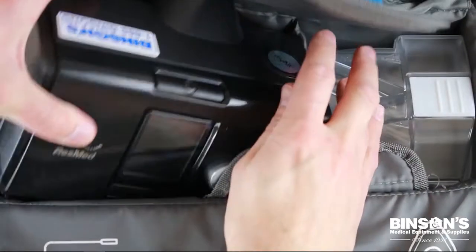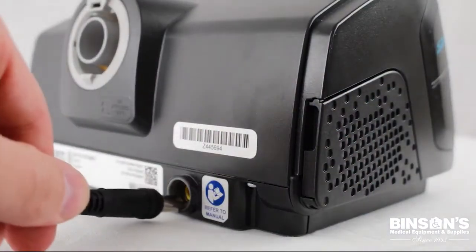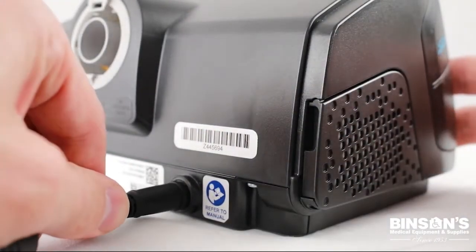Take your device out of its bag. First, connect the power supply to the back of the device. Then, plug it into a wall outlet.